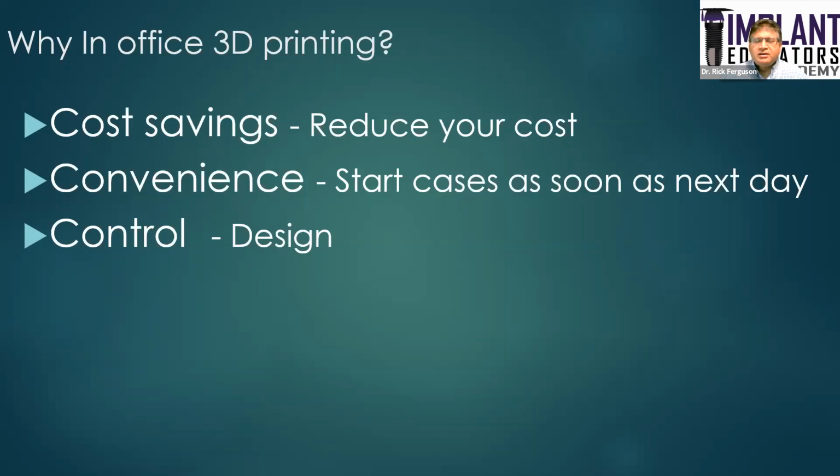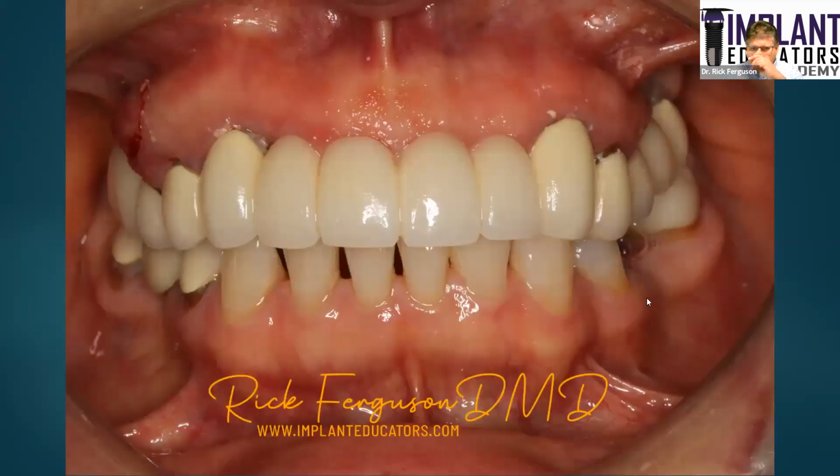Last week, we had our live surgery last Friday, at our implant continuum. And this was one of the cases that we did. So I did not get the final data sets. This was a case that was sent to us by one of our past doctors who took the course. This patient couldn't afford to have treatment, so we did the treatment, at least the implant part of it, at our implant course, where the doctors in the course got to actually do the treatment.